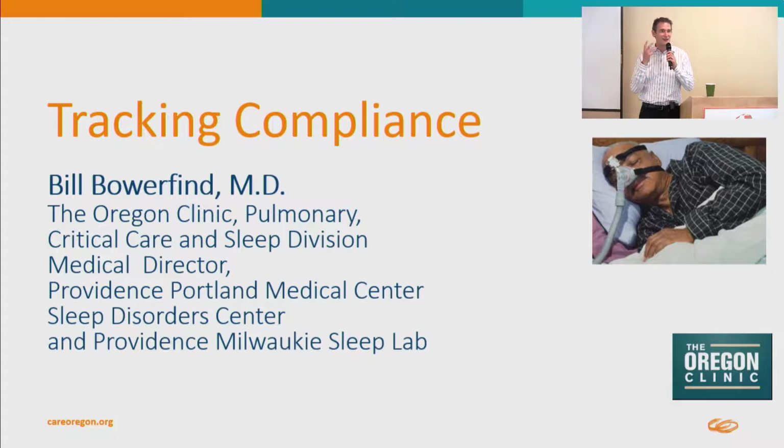I always tell patients, you can take your mask, dip it in mud, put it in the Soclean device, and it will come out with sterilized mud on it. So all the oils and all that stuff are still on there, and patients still have to go through that. Also, it smells like ozone. So patients have to put it in right after they use it, and then take their mask out and let that smell dissipate so that they're not inhaling that all night, because that can be irritating. I don't sell Soclean devices or anything like that. A lot of patients ask about them, and there are limitations to what those things can do.